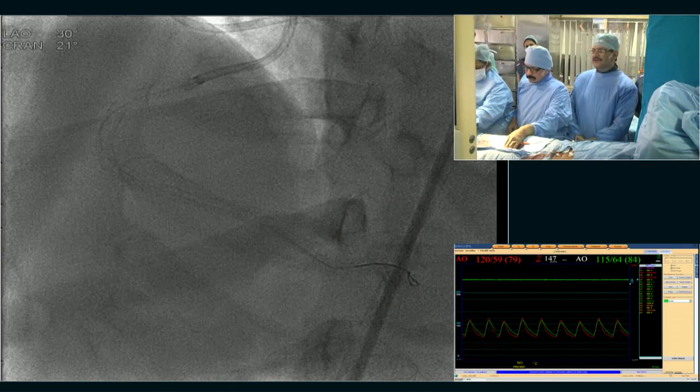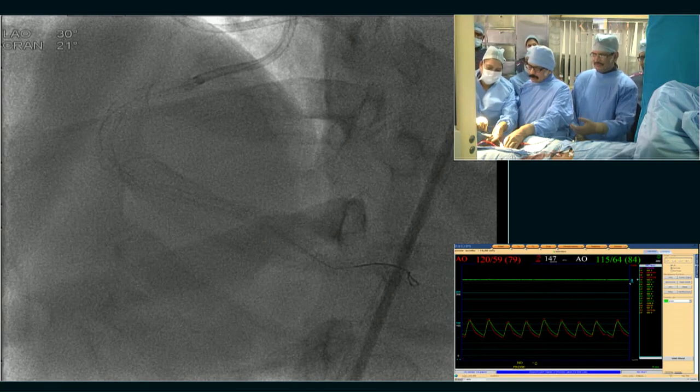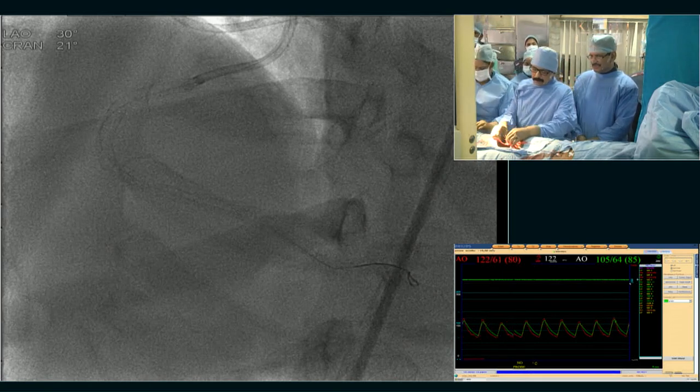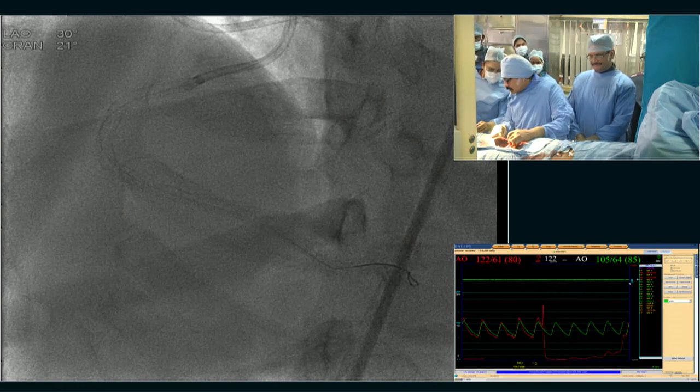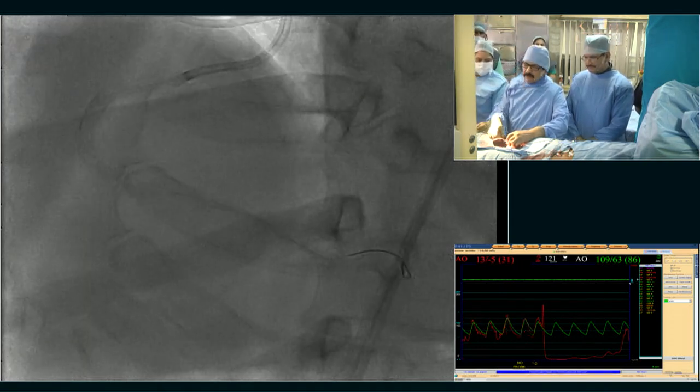That is more important for me. I think it is a protected PLV, like a protected LAD with a bypass. So better you have a good stent dilatation with the post-dilatation balloon 3.5 and 3.5, having a good TIMI 3 flow to the PDA. New balloon. Okay.